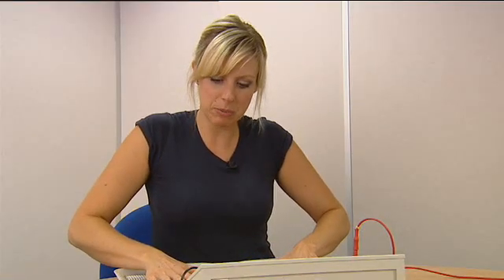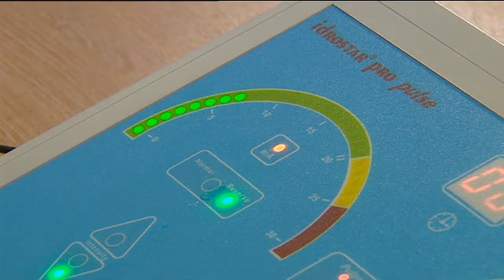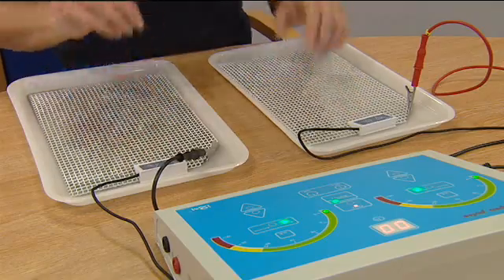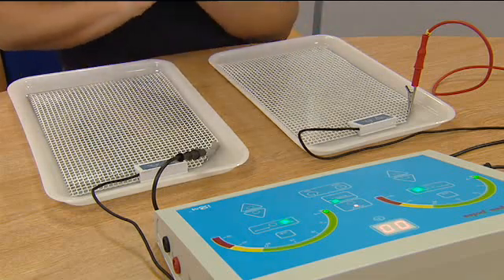Restart the treatment, and after 10 minutes, turn the power down by depressing the downward arrow until there is no visible current. The treatment is now complete. Dry hands and completely dry the machine and parts.